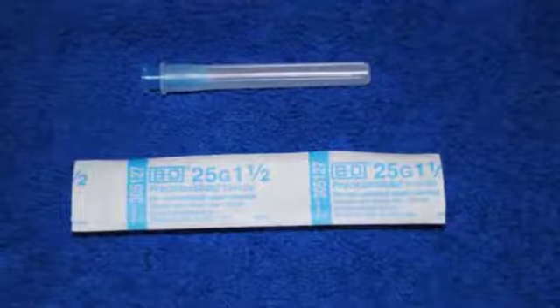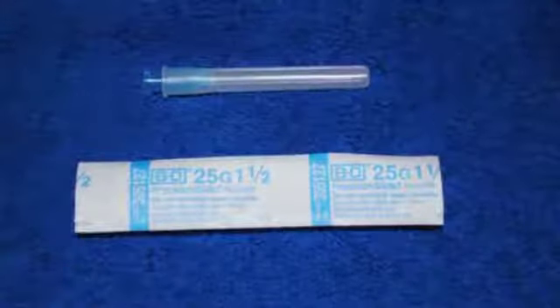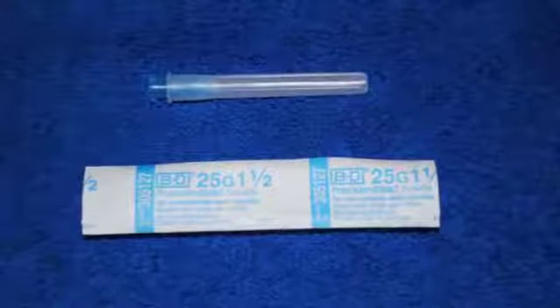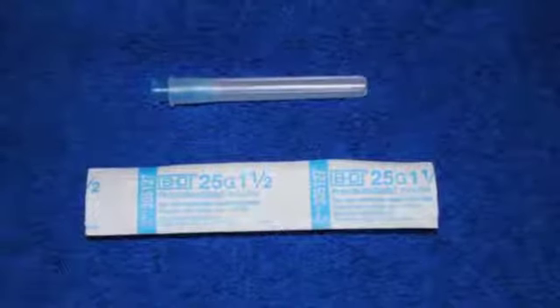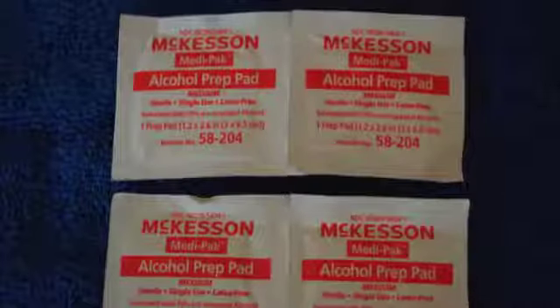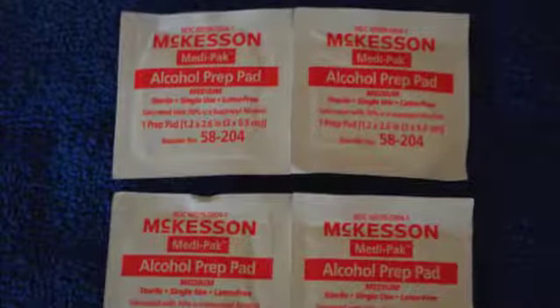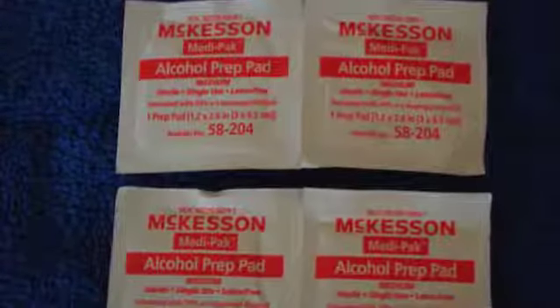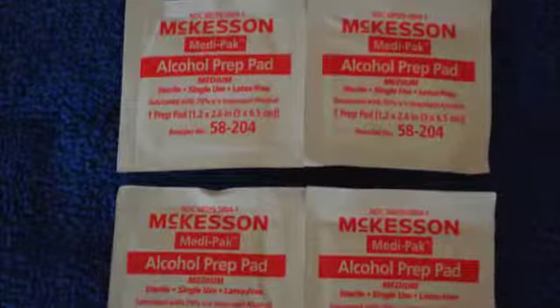25 gauge hypodermic needle. Shown here is a 1.5 inch length. This is appropriate for the gluteal injections. However, I recommend the 1 inch needles for injections in the thigh and the deltoids. You will need at least 4 alcohol pads, 1 to cleanse the vial of testosterone and 3 to cleanse the injection site. You may also use a bottle of alcohol and cotton balls if you prefer.